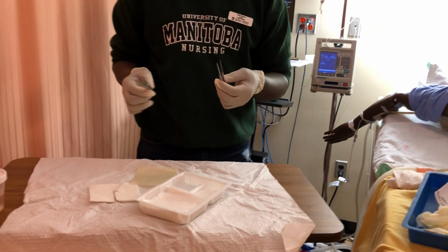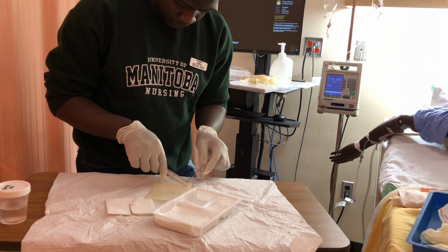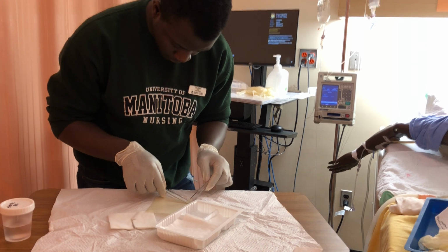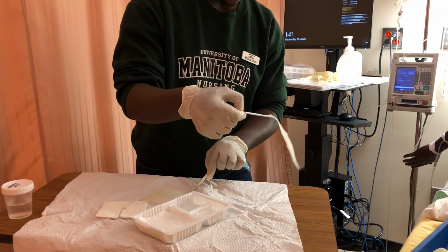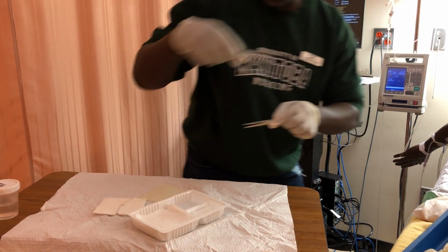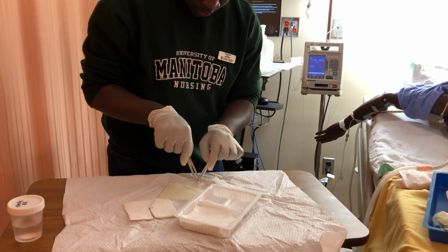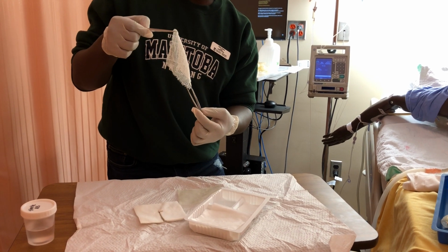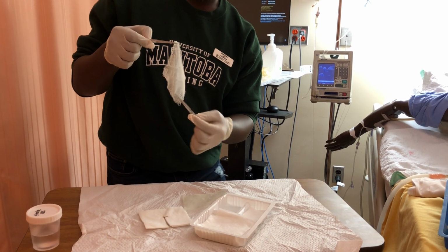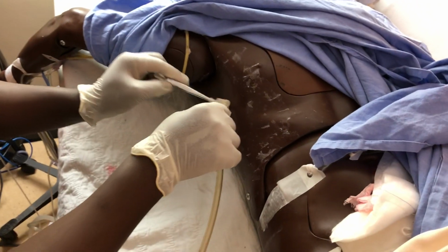So now I can start putting on my dressing. I have to start with my Jelonet. So just peel up this Jelonet, and I can just put that up there. And the other side, I did wet it by a tiny bit. So I'll just wrap this around so it can fit nicely around my chest tube. Everything looks good.